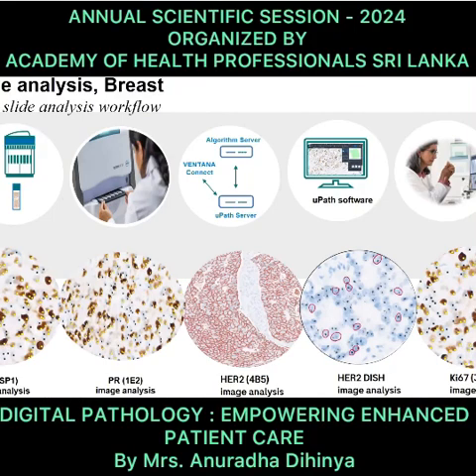With research use based algorithms, there is a validation process which CAP also talks about. CAP guidelines describe the procedure you need to follow, so you have to do a stringent validation process if you go ahead with a research use algorithm. So in the market, you will find this combination of CE-IVD approved algorithms and RU-based algorithms.